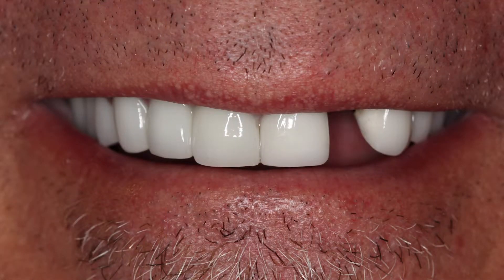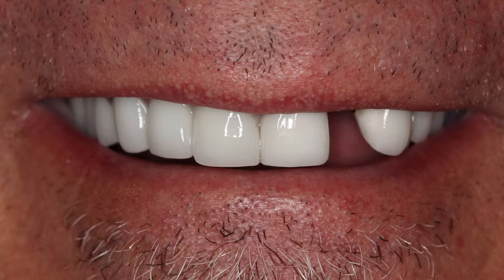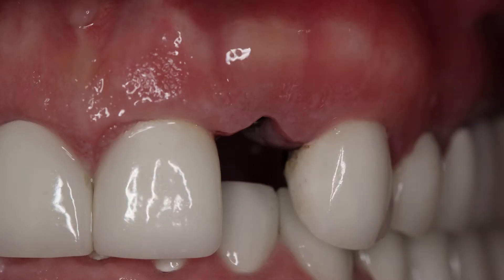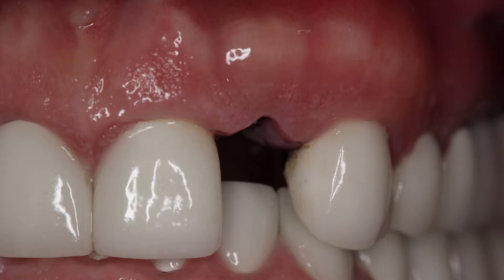Let's look at our first case here, the restoration of a maxillary lateral incisor. Figures 1A and 1B illustrate a patient that originally presented with a conventional crown retained by a post and core in the maxillary left lateral incisor. The tooth had fractured. The patient elected for a dental implant restoration rather than replacing a post and core and crown. The tooth was extracted and an immediate implant placed.